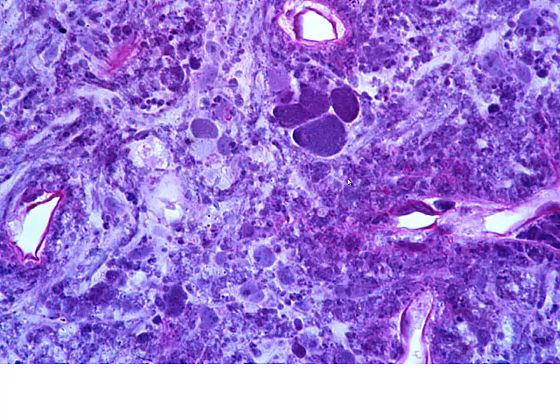Now, this is going to be the look in the neurohypophysis, just a very busy look. But these are all the herring bodies that you can see with this particular stain in this tissue, and it's hard to make out even the nuclei of these cells because the herring bodies in this neurosecretory material are staining so darkly in this tissue.